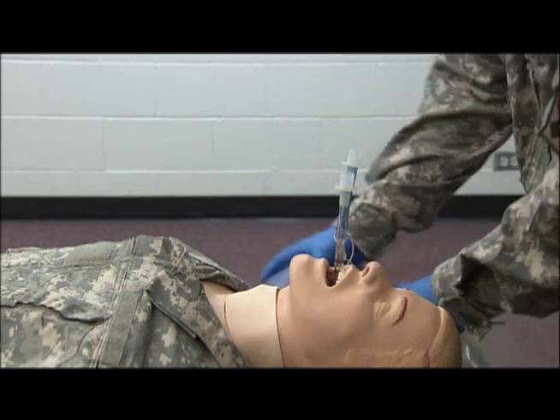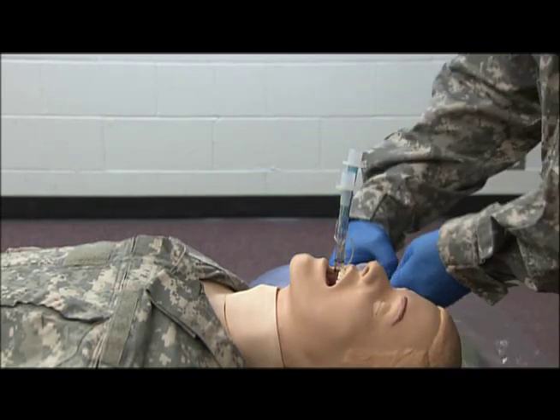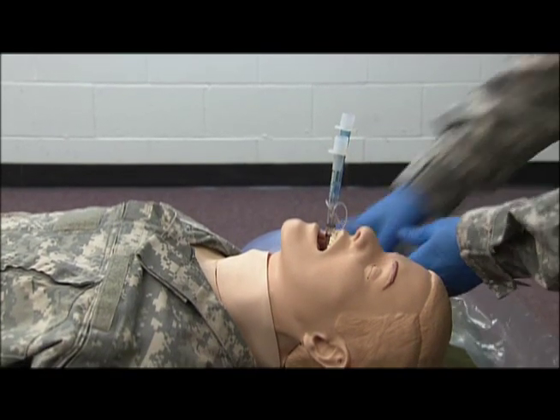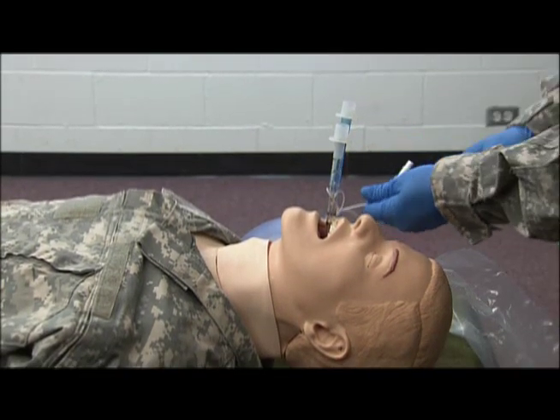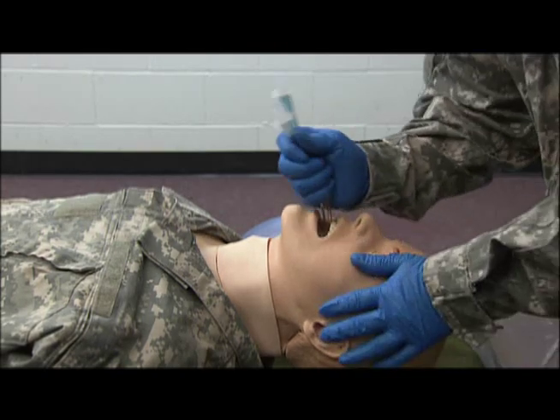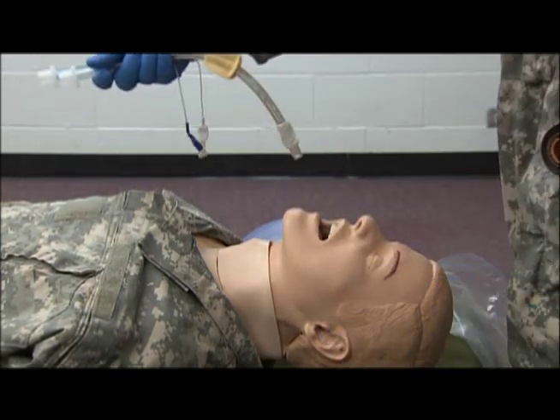Now, if the casualty becomes conscious, I'm going to immediately deflate both balloons and remove the combi tube.